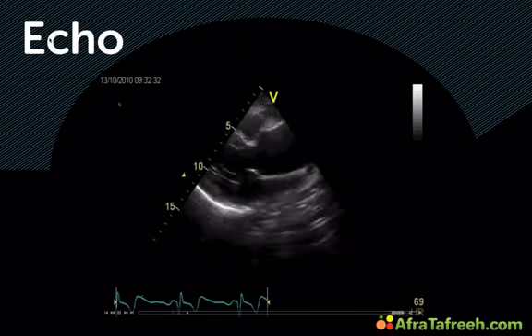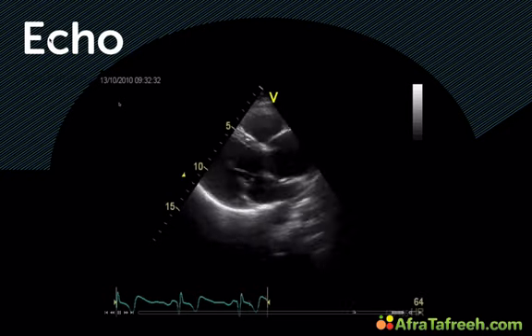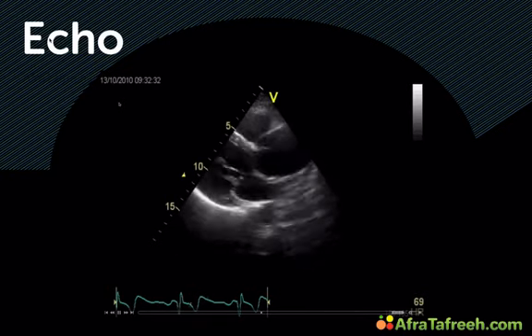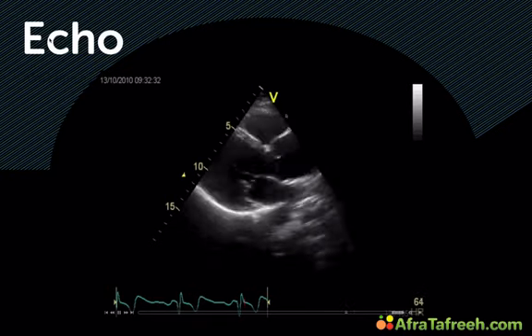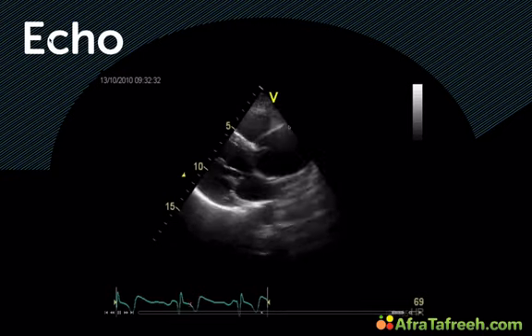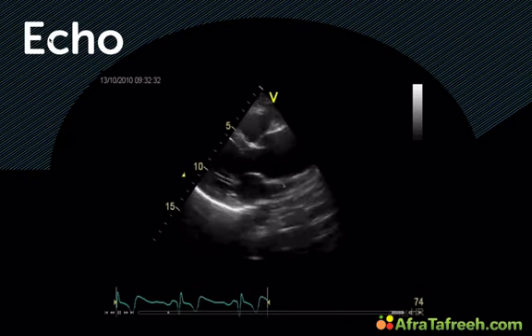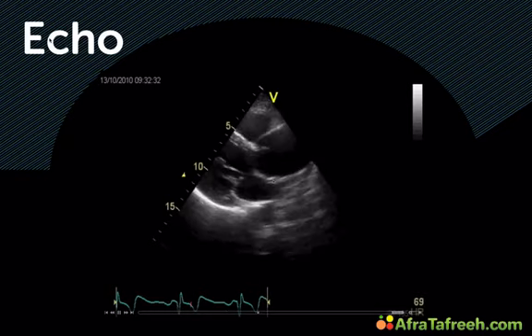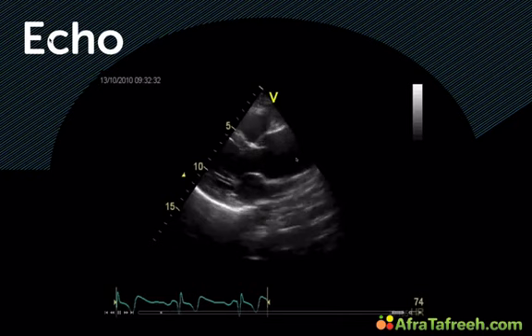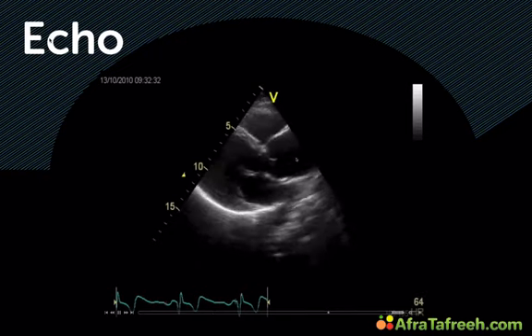Take a look at this parasternal long axis view, and those who've already performed the masterclass and came across a chapter on aortic pathologies will notice that there is something wrong with the aorta. Just to give you a bit of a clue, the problem is obviously the width of the aorta. Remember, usually we compare it also with the size of the left atrium, and the aorta should be at least not more than 1/3 larger than the left atrium. In this case, what we clearly see is that the aorta is fairly large. Now, what does this point to? Remember, this is a fairly young individual where we do not expect to have a dilated aorta.